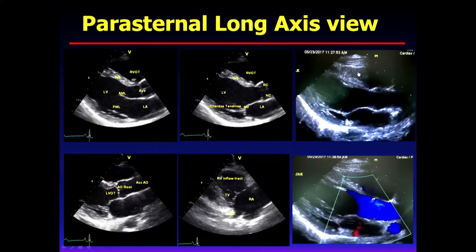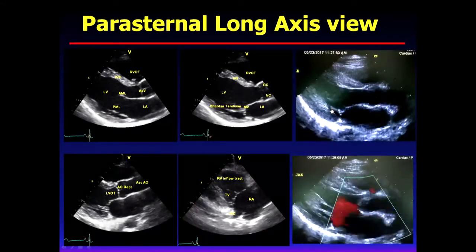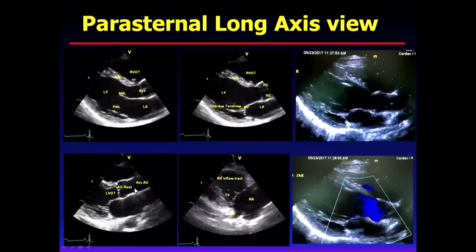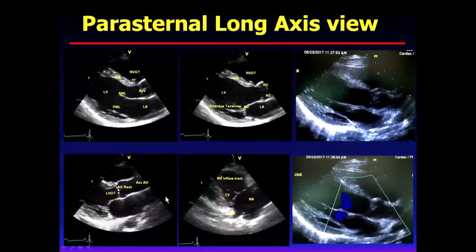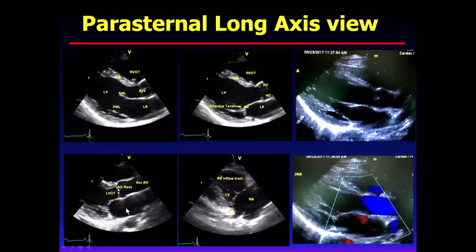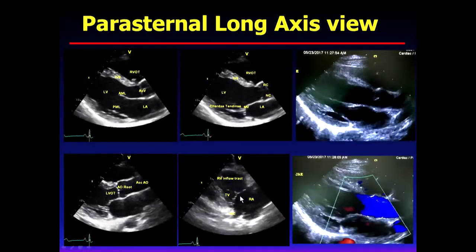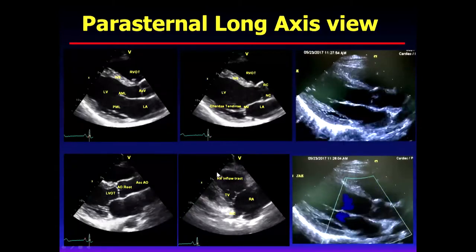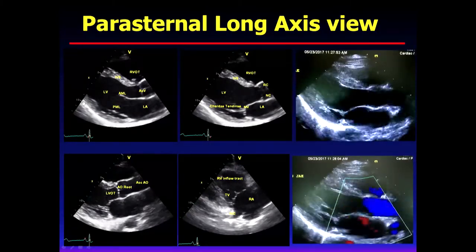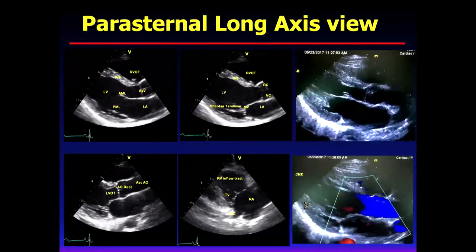And this movement gives us the information about whether the heart is pumping well or not. And here also, the LV outflow tract and aortic root and ascending aorta. If something happens here, we can notice it in this view. And then here, with a little inside sweep, we can notice the tricuspid valve and RV in movement. And this is the standard view, with movement and color Doppler in it.